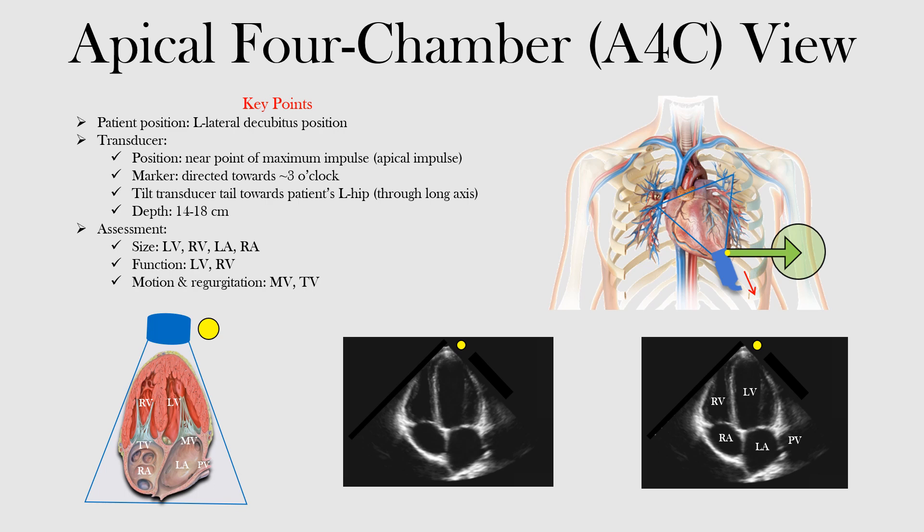We've made our way through the parasternal long axis view and the different views in the parasternal short axis view, and now we're making our way to the apical four-chamber view. With the parasternal long and short axis views, we had our patient in the left lateral decubitus position — we'll also have the patient in this position here. We're going to move the transducer to or near the point of maximal impulse, the apical impulse, which is about here at the apex of the heart.